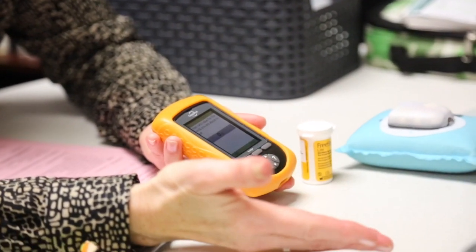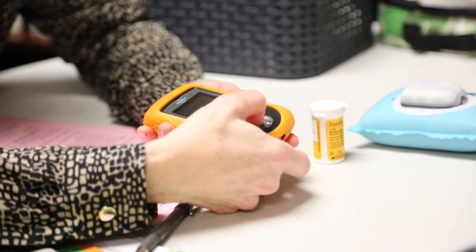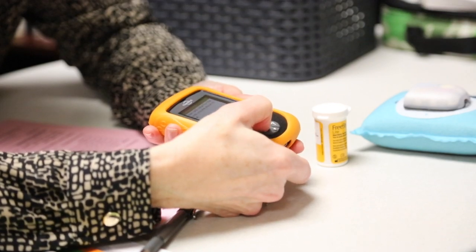So we'll program this for active insulin at about 2.5 or 3 hours. So that if you put in a blood sugar at 2 hours, it will know that you still have insulin on board. And it will suggest a lower dose than if you had no insulin on board. Okay. Wow. That can be really helpful. You can eat more flexibly. That'll be nice. With safety, and I see the smile there.